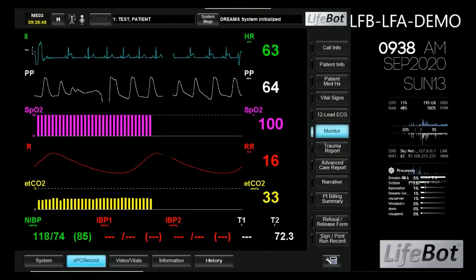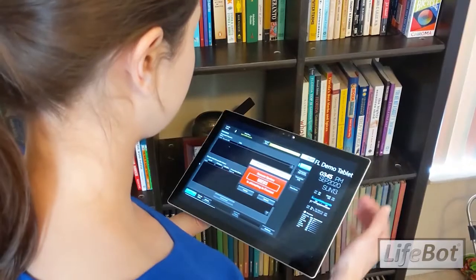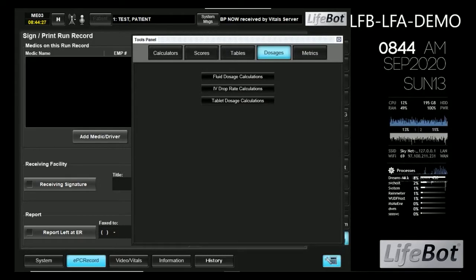Hello, my name is Justin Kirkwood and I'm going to introduce you to the LifeBot telemedicine system. We'll hook up some peripherals to the vital signs monitor, make a call to a physician, and review some of the system's advanced features.